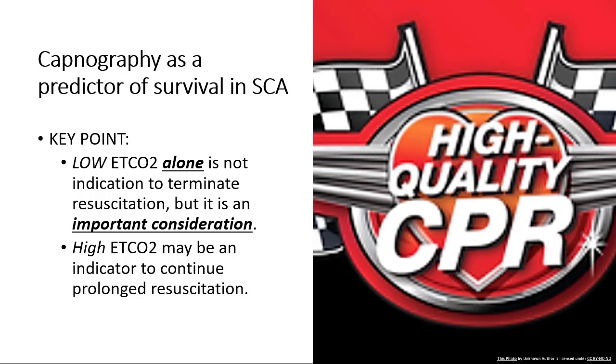But I will say that if after 20 minutes or 30 minutes or 40 minutes or 50 minutes or 60 minutes or even longer, you have a good end-tidal CO2, continue resuscitation.